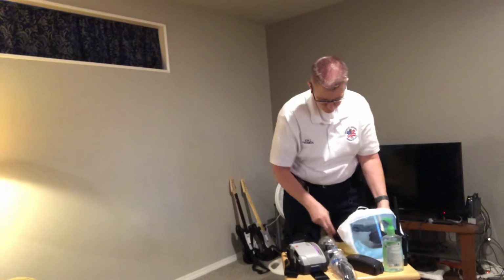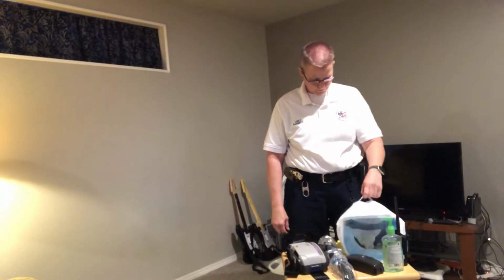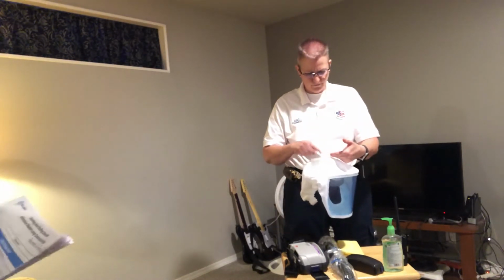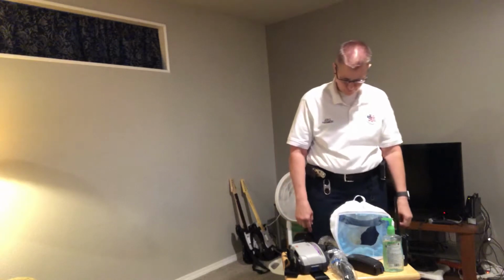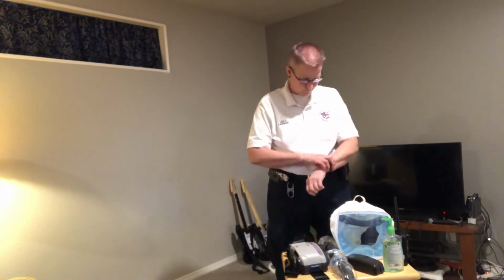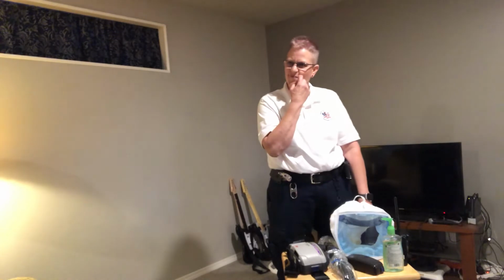And so normally in a non-crisis scenario, you would want to write your name, put a label maker on it, do something on the hood, just to make sure that it's yours, that nobody else confuses that hood for theirs, and just little things like that we can avoid. With this, please don't put your name on it. We don't have a lot of these as of right now. This is the only one, so please don't decide to label it or we're going to make fun of you.